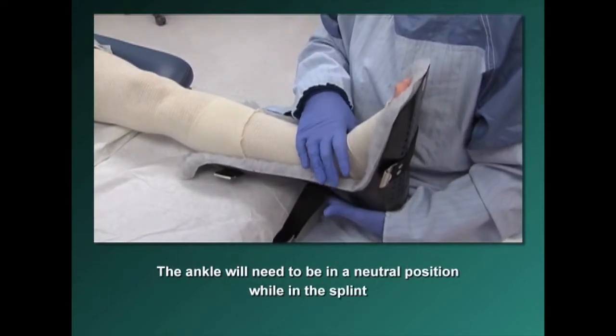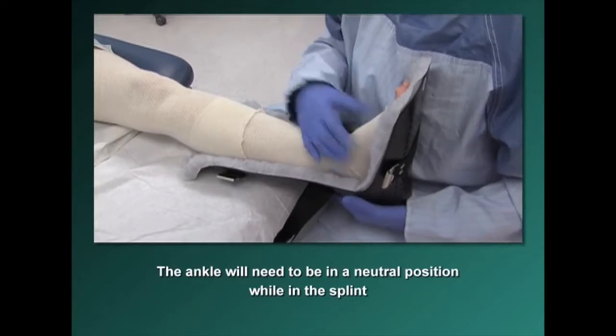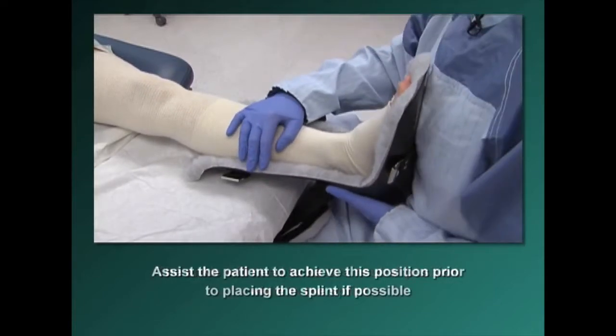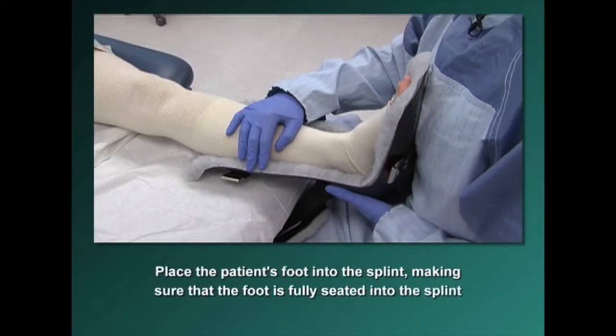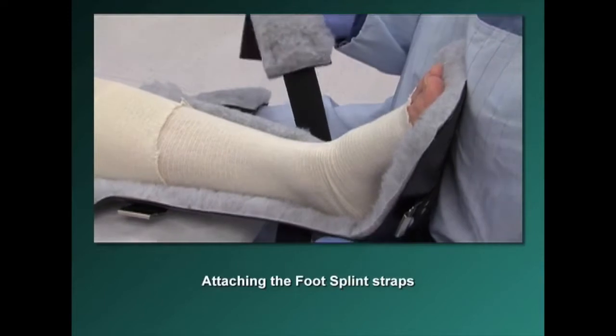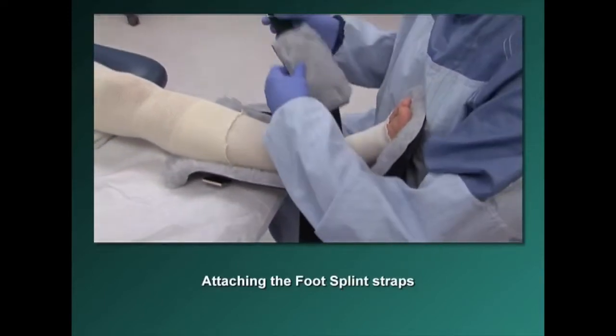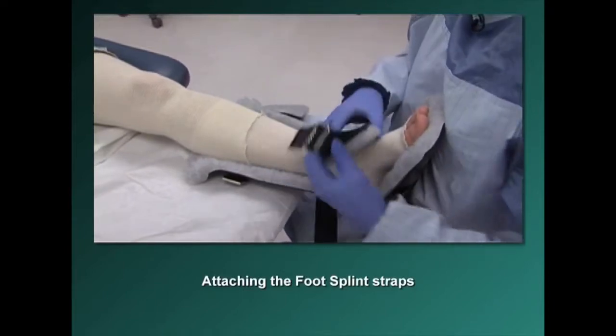Firmly press the foot down and make sure it seats fully in the splint, sliding the heel down as far as possible. Assist the patient to achieve a neutral ankle position prior to placing the splint if possible. Place the patient's foot into the splint, making sure the foot is fully seated. This splint has three straps: two go across the foot, and one goes across the mid-leg. Start with the padded strap going right across the foot.